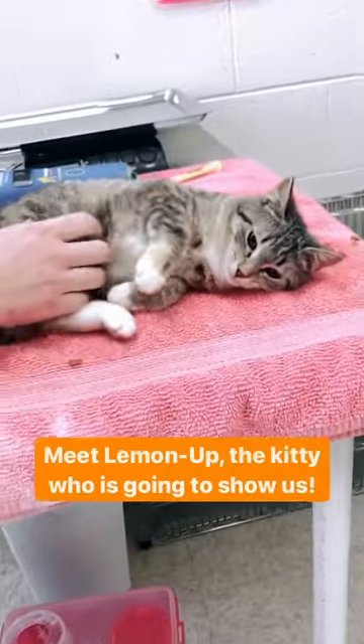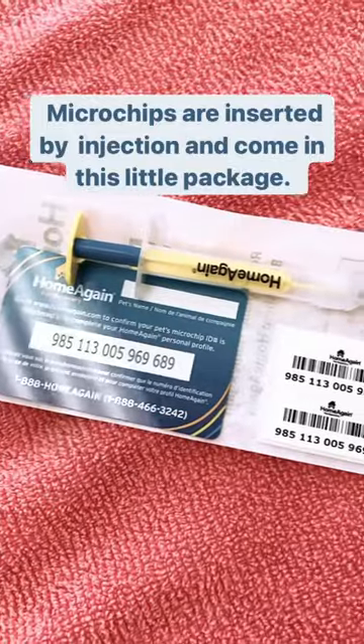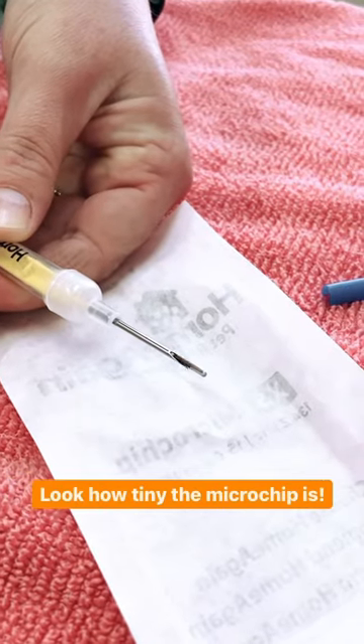Ever wondered how microchipping works? Meet Lemon Up, the kitty who is going to show us. Microchips are inserted by injection and come in this little package. Look how tiny the microchip is.